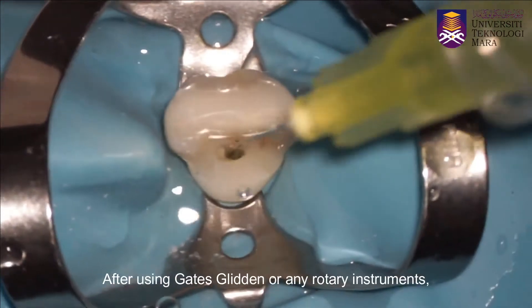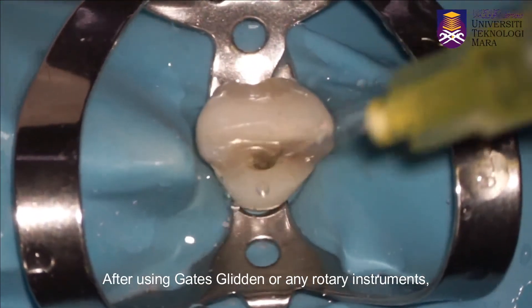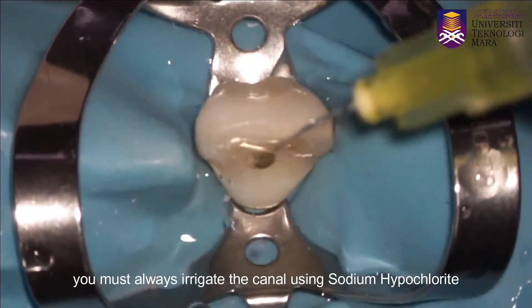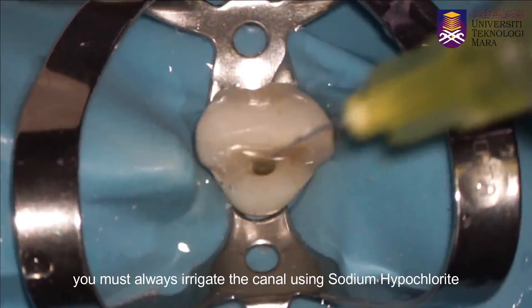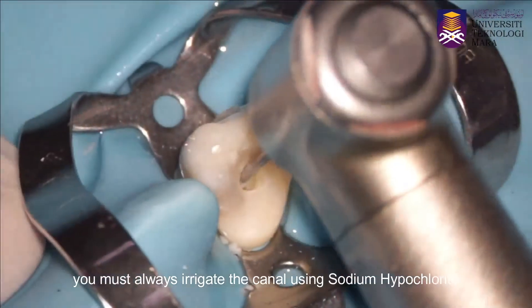After using Gates Glidden or any rotary instruments, you must always irrigate the canal using sodium hypochlorite.